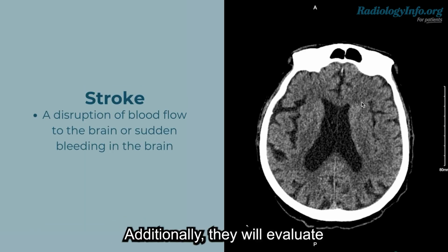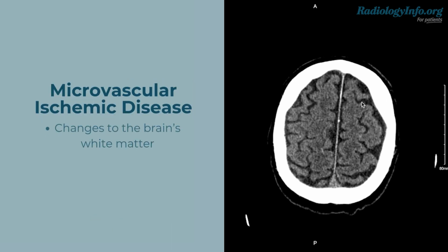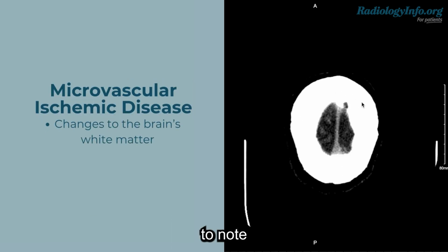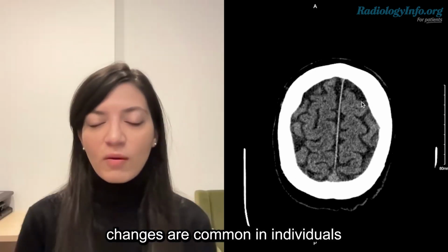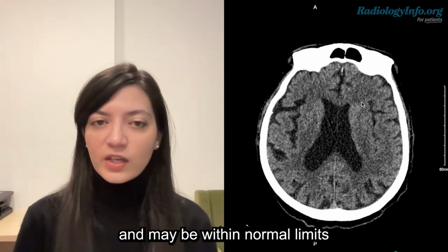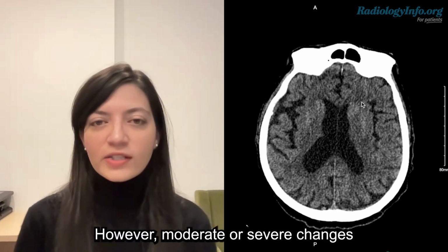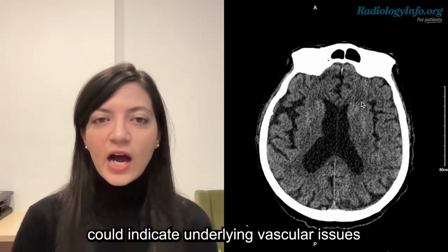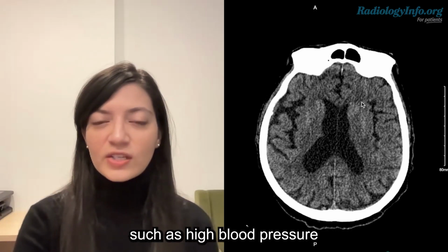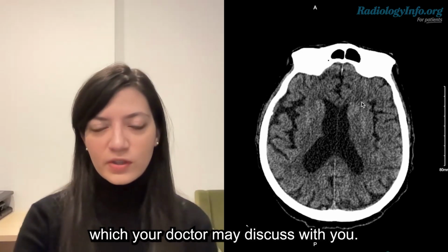Additionally, they will evaluate white matter changes, which are related to microvascular ischemia. It's important to note that white matter changes are common in individuals over the age of 60 and may be within normal limits for your age. However, moderate or severe changes could indicate underlying vascular issues, such as high blood pressure or high cholesterol, which your doctor may discuss with you.